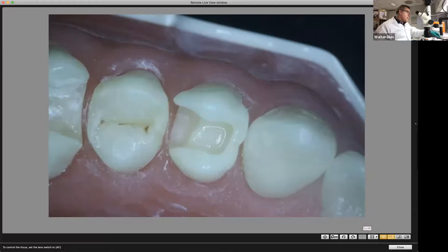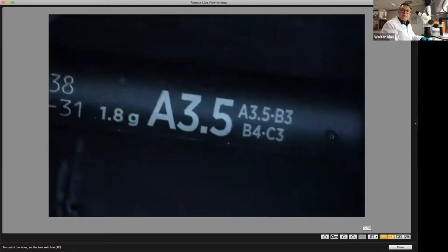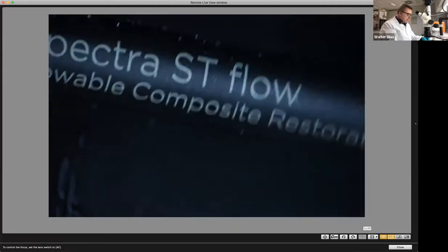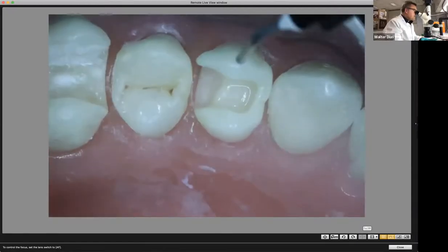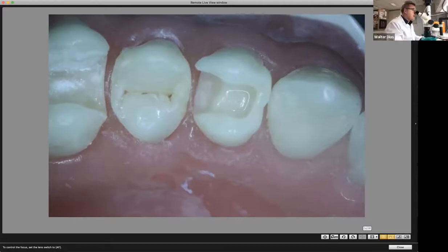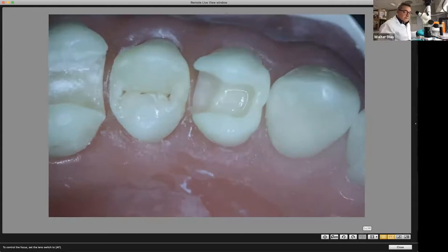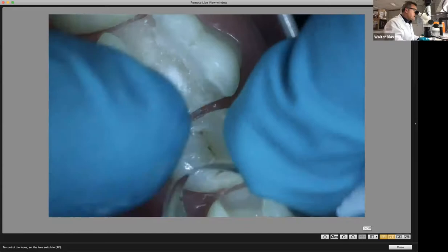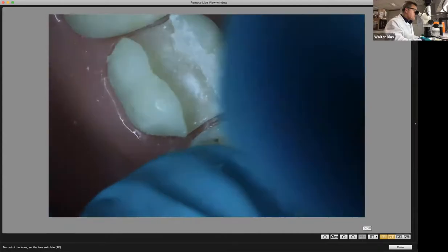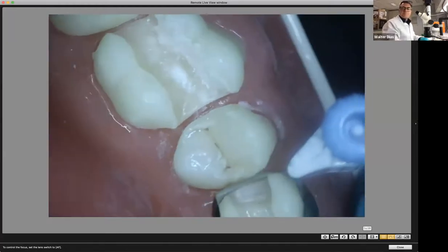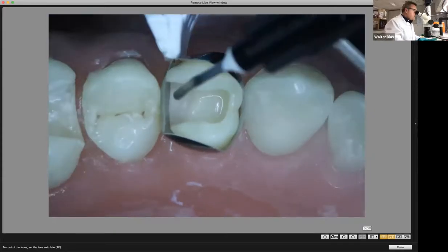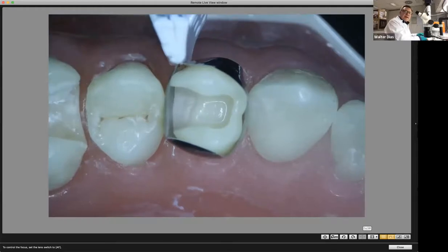For aesthetic areas, I think you should use a flowable. I like the A3.5, which gives you a lot of chromaticity internally. This is the Spectra ST Flow from Dentsply's composite family. In this case, we're going to do the immediate dentinal sealing with the flowable. The difference is that when applying the flowable, you really need to keep it in a thin layer. We can apply the Paladin 360 matrix to be more accurate.